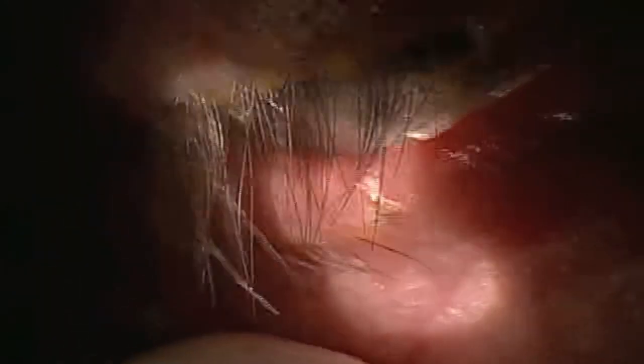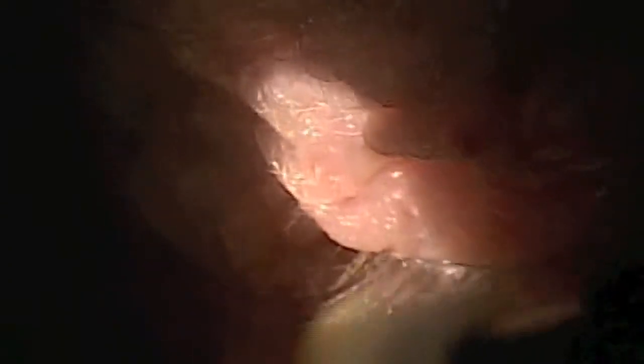Ideally we would like the handpiece to be held a little more vertically, but there are constraints to positioning due to being at the slit lamp. The treatment is best performed on the right eye with the doctor's right hand and on the left eye with the doctor's left hand. You can now see the nearly complete elimination of the crusting from the patient's lower lid.